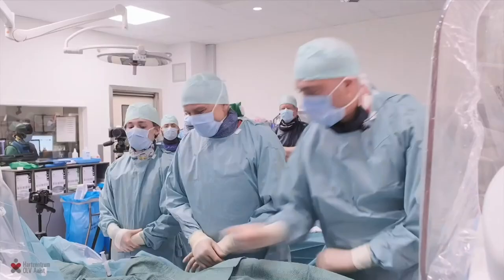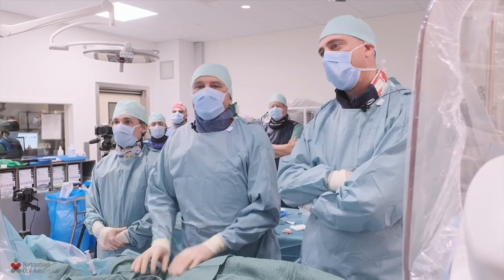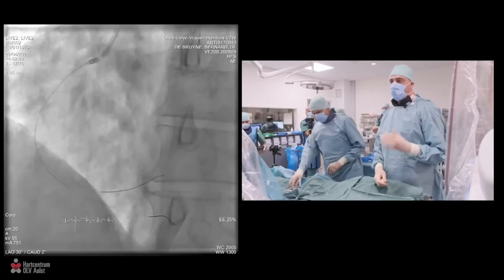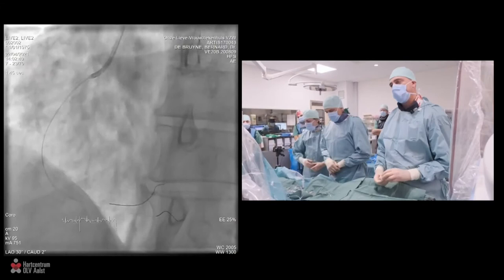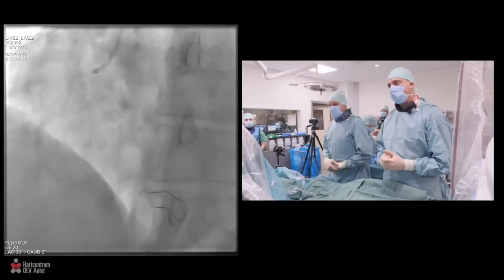So the goal of this session will be to interrogate the three vessels with invasive measurements on the basis of this Insight LifeTech TruePhysio catheter, which is a microcatheter, an over-the-wire microcatheter to measure the fractional flow reserve. Okay, so as you can see, we have put two wires, one in the PD and one in the posterolateral branch of the right coronary artery. And I would suggest now that we introduce the setup of the machine and the wire, the unpacking and the complete installation.